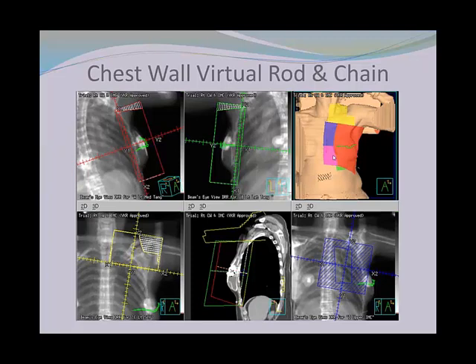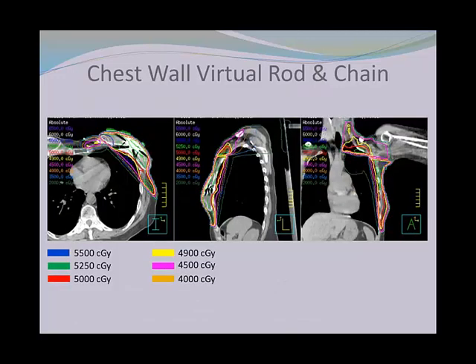One is the use of the couch. It's important to know what type of couch the patient will be treated on. You have these IGRT couches, and these couches don't have the metal rails on each side like the traditional couch, so you don't have to worry about the beam being attenuated through those metal rails.